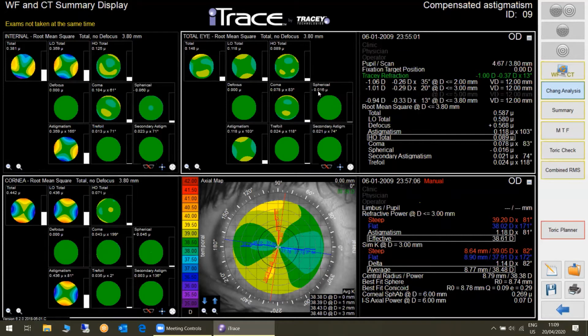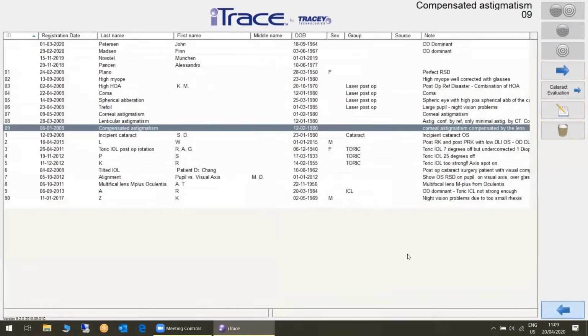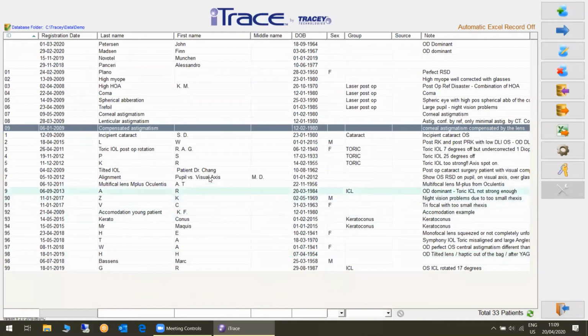So his brain does not like the image that he's getting from the cornea. So it will give an order to the lens, do something about it, and he's accommodating to make it better. How can I prove this to you? Let's go and have a look at accommodation.